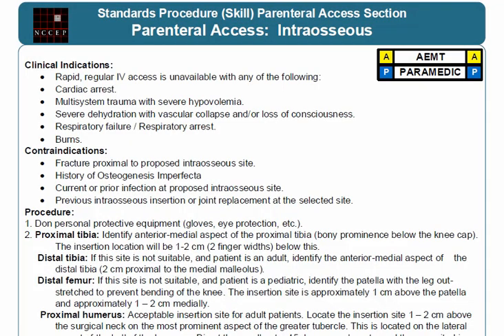Next item, want to make a mention of PAS 11. This is parenteral access intraosseous. Again, they have expanded the utility of the intraosseous access now such that advanced EMTs as well as paramedics can perform the skill. Again, it would be suggested to have an EZIO, that's the bone drill, for this form of access, and this is a very simple, almost like a carpentry type of procedure.